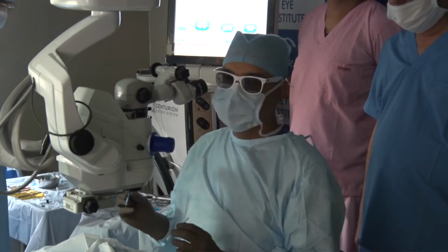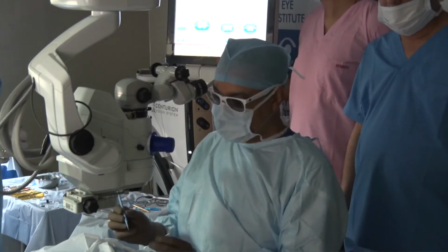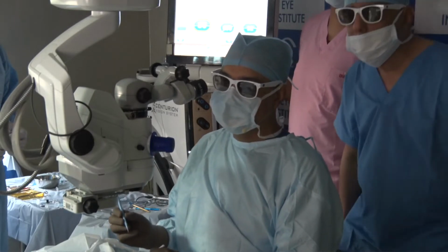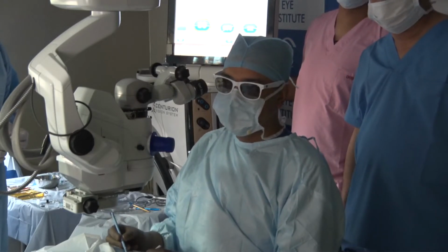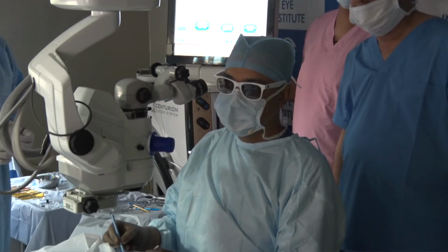Thanks, Dr. Tulsi. So we are going to use the IPCL, the toric IPCL. I've been using them for a few years and I'm very happy with the results. The vault and everything is nice, and they come in sizes which are very good because they come in steps of 0.2 instead of the 0.5 which is there with the other ICL that we use. So here I'm going to make my 2 incisions, and I don't know if you are getting the 3D effect or not, but I'll try to show you a 3D image.